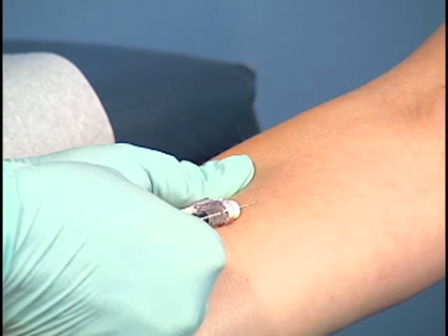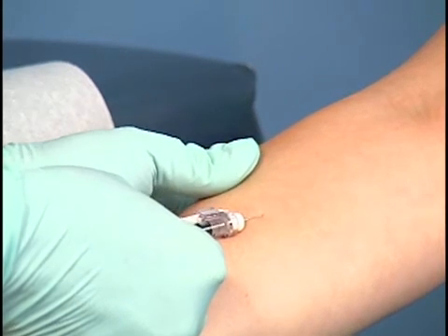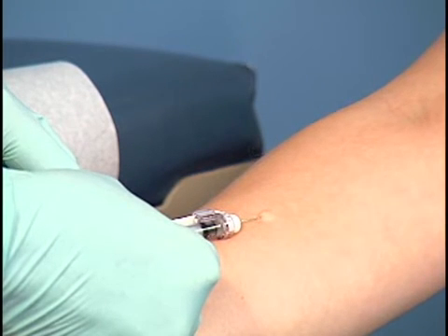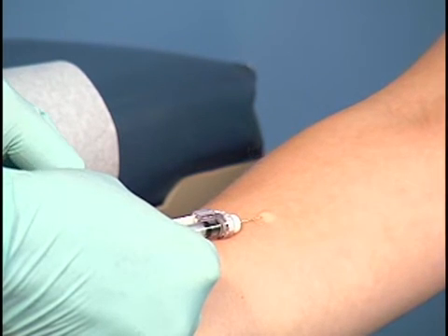No aspiration is needed. Hold the syringe steady and inject the medication slowly and steadily by depressing the plunger. As you inject the medication, a firm, tense white wheal forms. Test results are considered reliable only if a wheal forms. Expect to feel a certain amount of resistance as you inject the medication. This indicates that the needle is properly located in the superficial skin layers rather than in the deeper subcutaneous tissue.